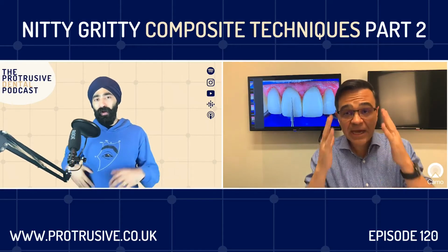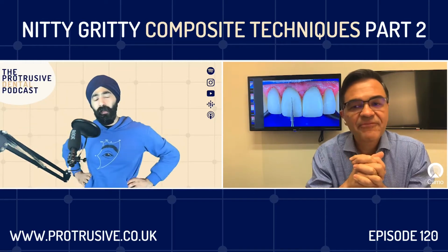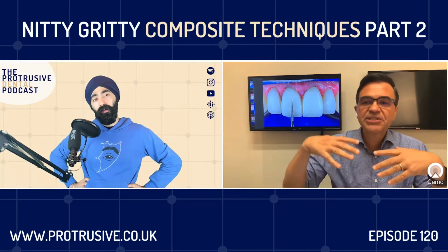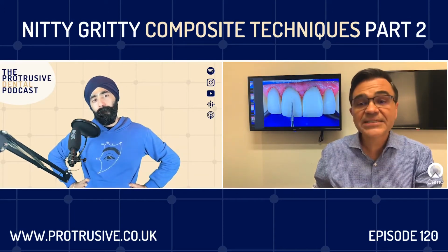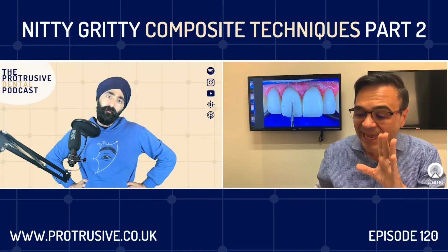When I finish my veneers, what speed are you using this at? So you got the carbide burr. What speed? At the beginning, very low speeds. Maybe 3,000 RPM, something like that. Very low. Okay. And then as much as I go, I go higher, and at the end I go very high revs.